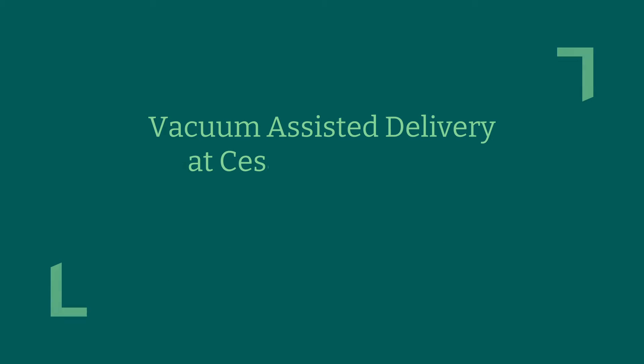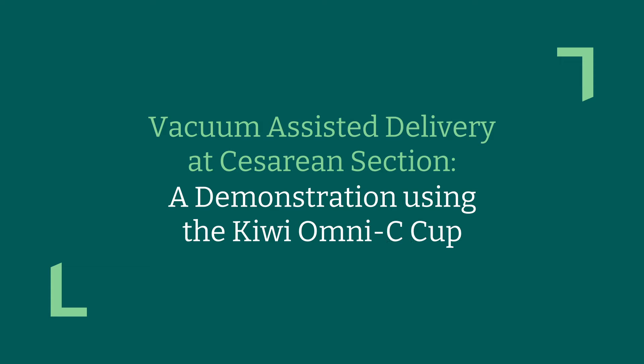Labri Medical Technology presents Vacuum Assisted Delivery at Cesarean Section, a demonstration using the Kiwi Omni-C cup.